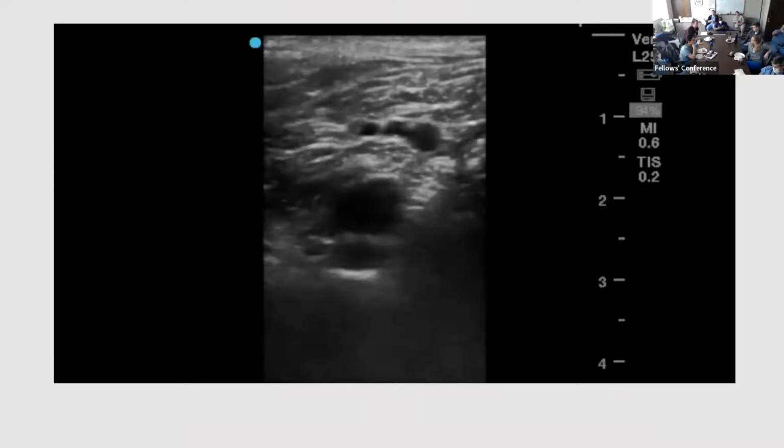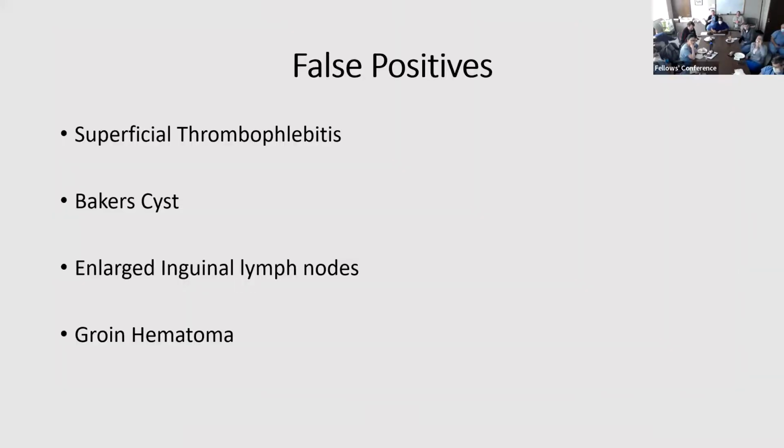Lateral perforator. Yeah, the lateral perforator. So you always want to make sure you get that lateral perforator as you're scanning down. Very good. Is the anatomy pretty consistent, at least in the vessels across some people? Yeah, it's very consistent.